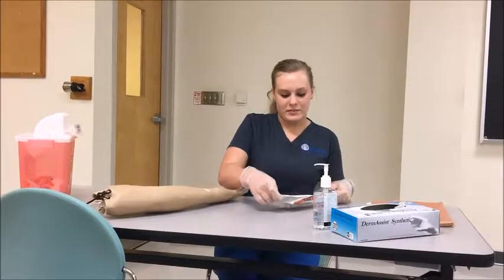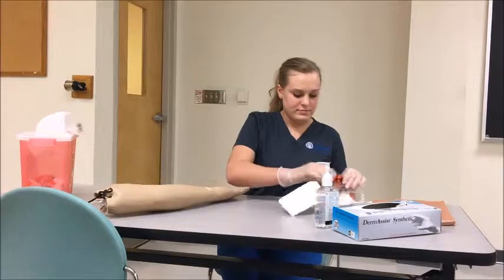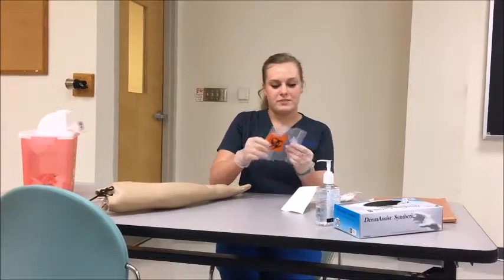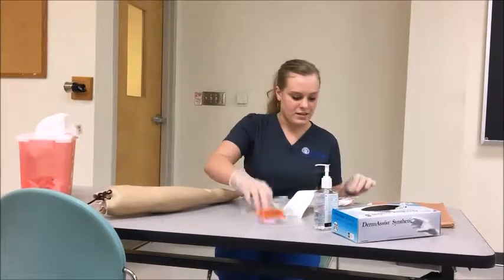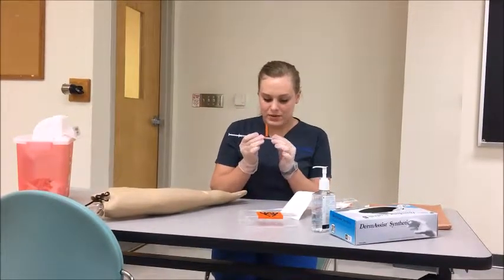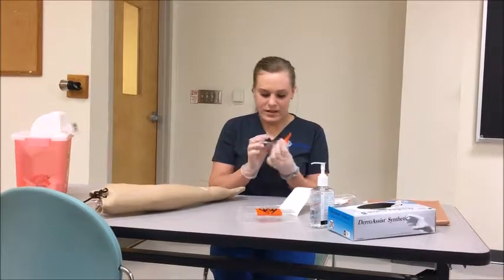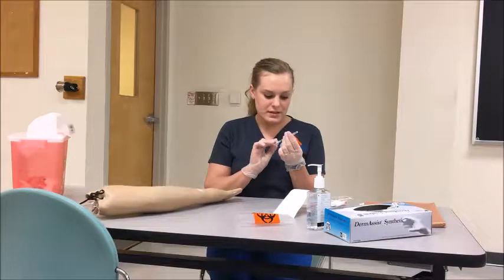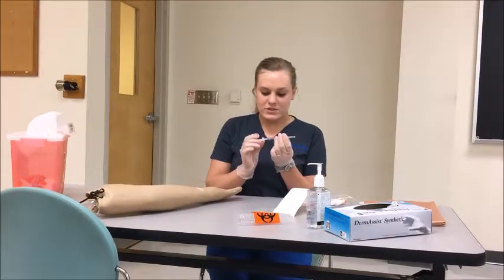I'm going to open my biohazard bag to put the syringe in afterwards and take it to the lab. Making sure I have my syringe ready with the bevel up and at the sample size I need. For today, I'll just be getting a 0.5 mL sample. If there were other tests to be performed on the patient, then I'd be getting a larger sample.